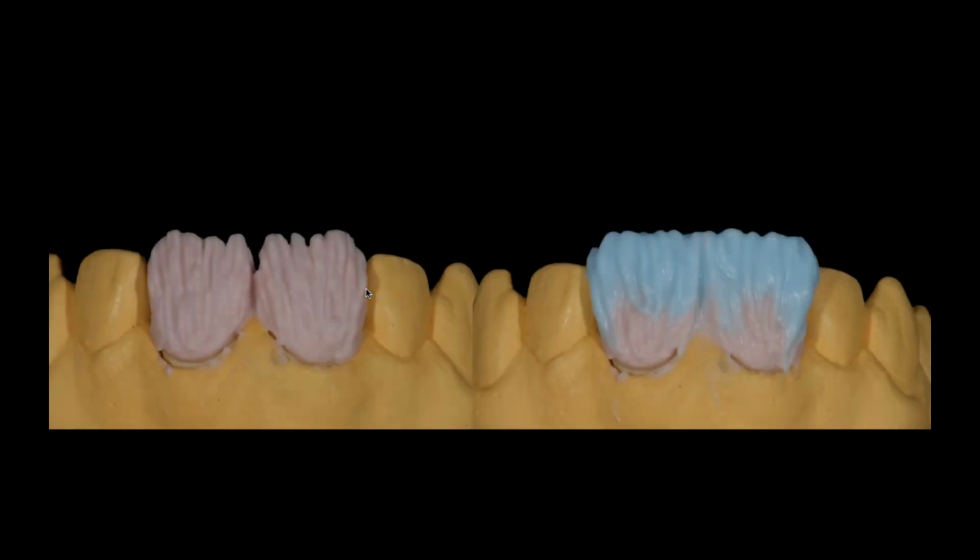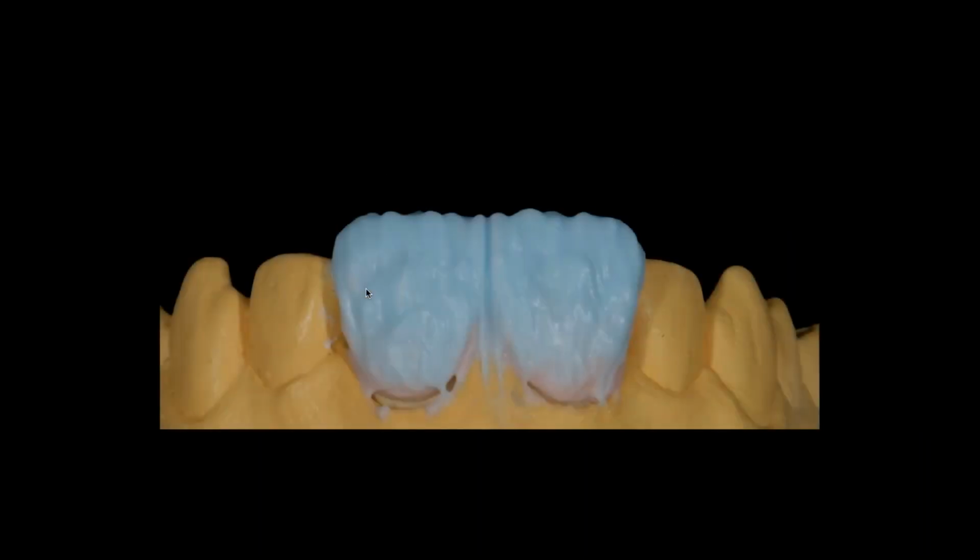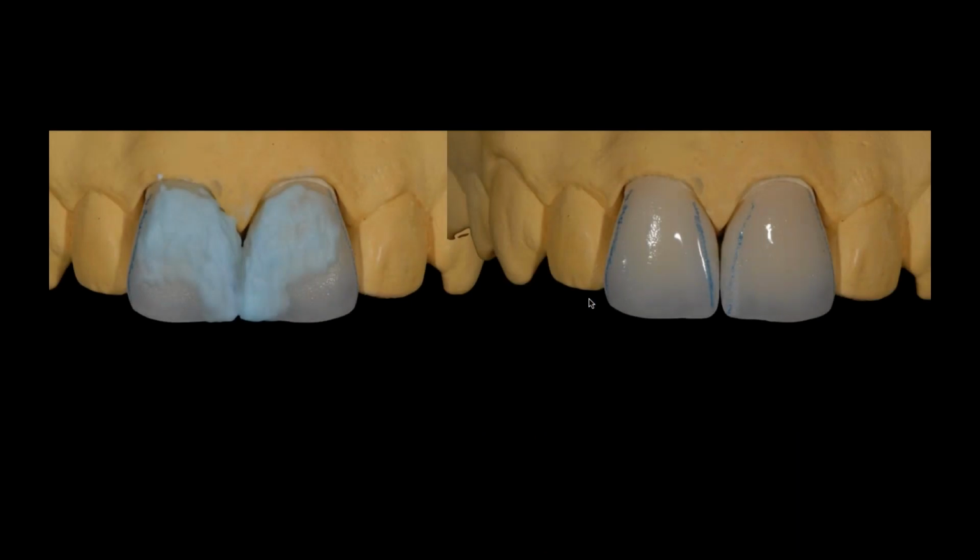So watch. I'll finish up my dentin buildup, create a little bit of a mamelon structure, start putting a little translucency on this. In this case, it could be the water drop or E9, whichever one you're comfortable with. And then in the end, I'm going to finish that with 1 enamel. So realistically, it's a 2 powder buildup, 1 dentin, 1 enamel for 1 tooth. But the other tooth has 4 opacious materials underneath it. And I'm going to fire both of those.